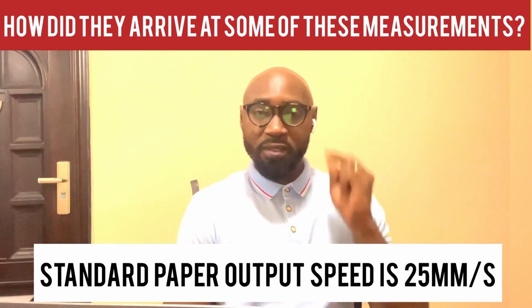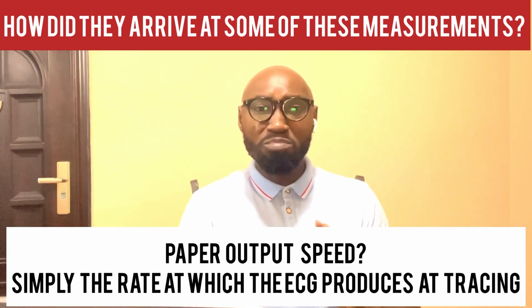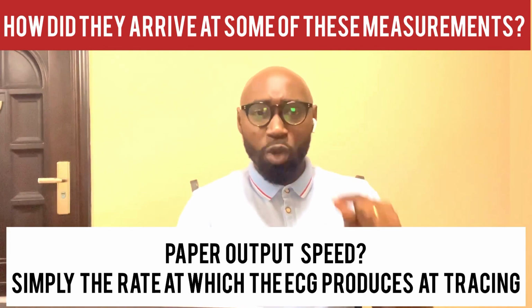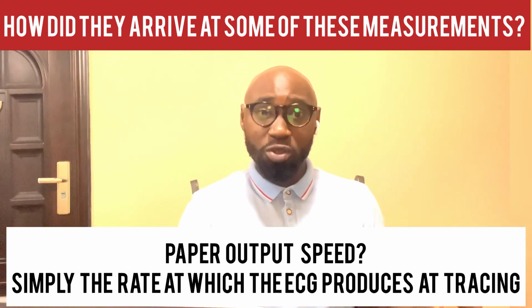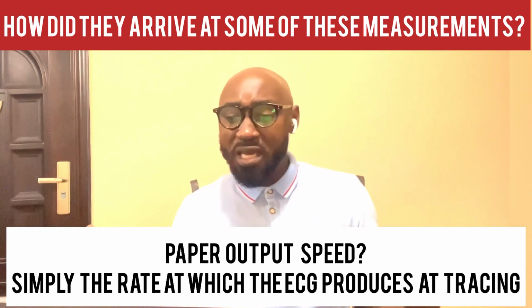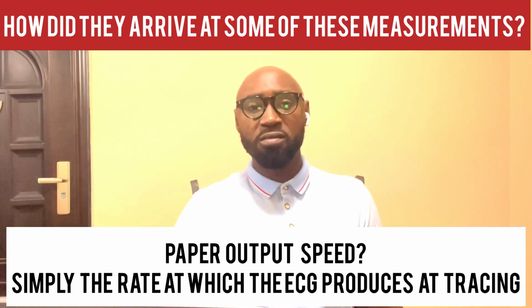This paper output speed just means the rate at which the ECG produces a tracing. It just means the rate at which the ECG produces a trace.